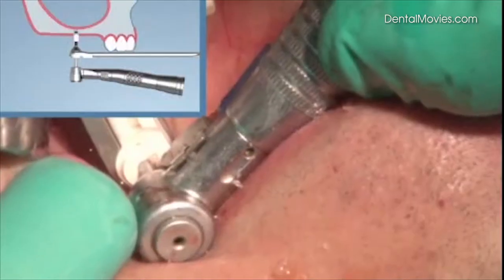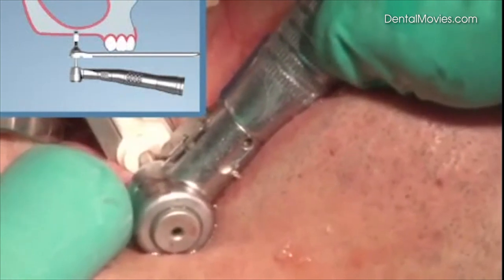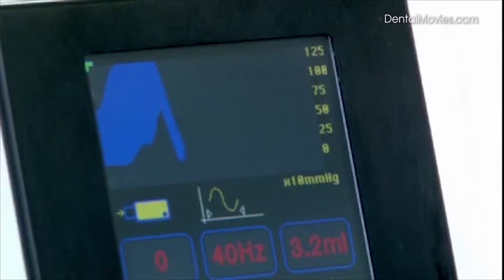Therefore, high pressure but no danger for the Schneiderian membrane, due to the small amount of liquid. Once sufficient pressure is achieved, drilling starts and continues until a pressure drop on the display indicates successful perforation of the bone.